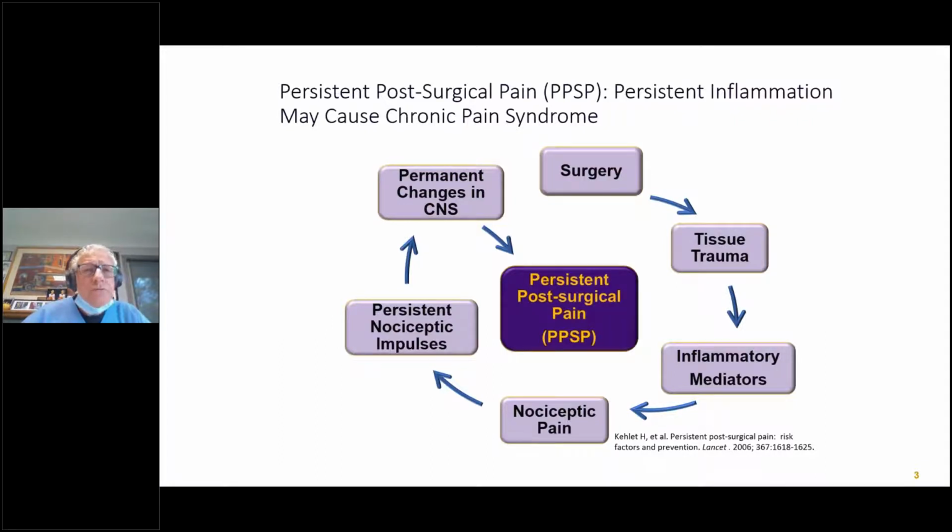In a chronic pain setting, which is really the setting that I work in, the goal is to mitigate chronic pain symptoms. So we use the Provant more as an adjunct to other techniques and interventions. We use a healthy dosing of neuroscience applications, which are cognitive behavioral approaches, and deal with some of the issues that many chronic pain patients have, along with not only the nociceptive part of the problem, but also such things as fear avoidance, kinesiophobia, and this patient population has a tendency to catastrophize. So those all need to be included in a treatment regime as well.